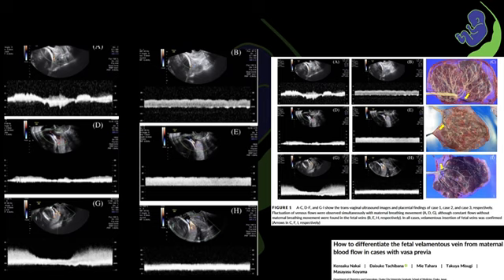Whereas if the flow is venous and there are no nearby fetal arteries, we should carefully trace the vessel to identify its origin, and if necessary we need to repeat the evaluation, and in some cases it may even be necessary to obtain a second opinion to confirm the diagnosis of vasa previa.